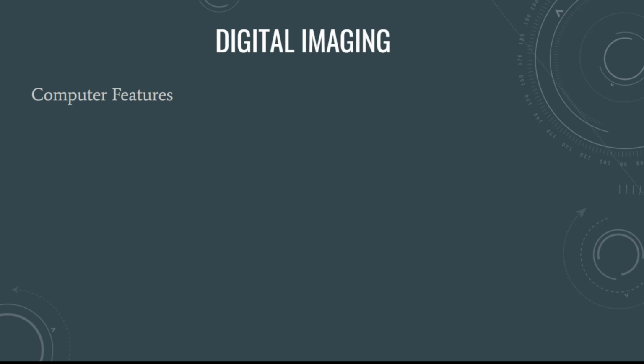On the computer, there's several different features that you can use. Some will offer a split screen, so you would be able to compare multiple images at one time. So we may be tracking the progress of a tooth to see if it does have an infection or maybe it has a fracture, and you need to see an image from today, and then in 6 months they come back, and then in another 6 months they come back. And you can see the progress of that tooth when you're comparing all three images or how many ever you have side by side.